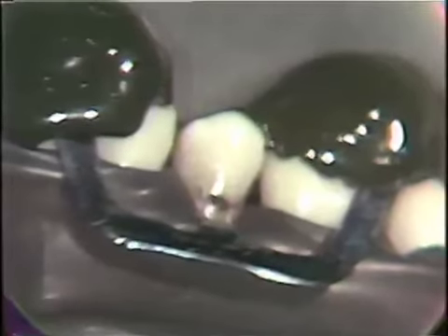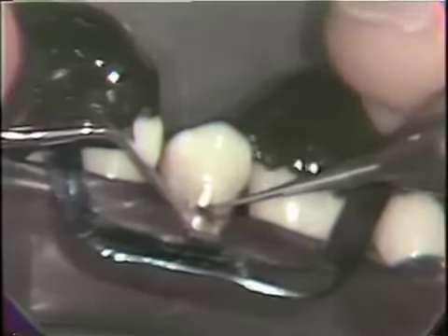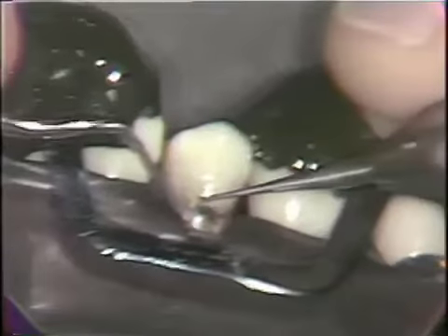We'll initiate the cavity preparation using a 33.5 steel burr in a straight handpiece, using the base of that burr to approach and establish then the mesial margin. I'm using also a plastic instrument to protect the rubber dam in this immediate area of the operating site.